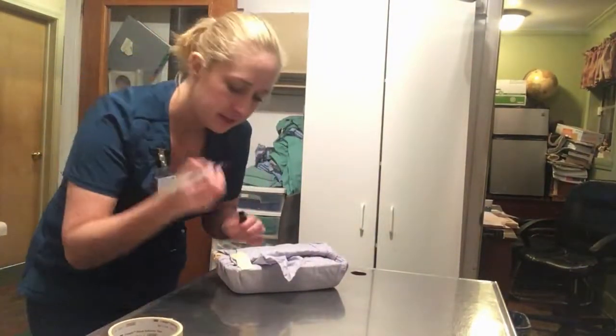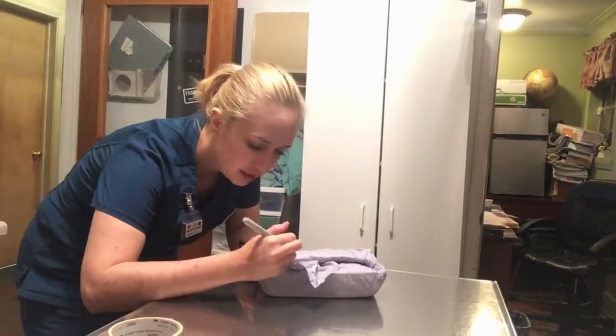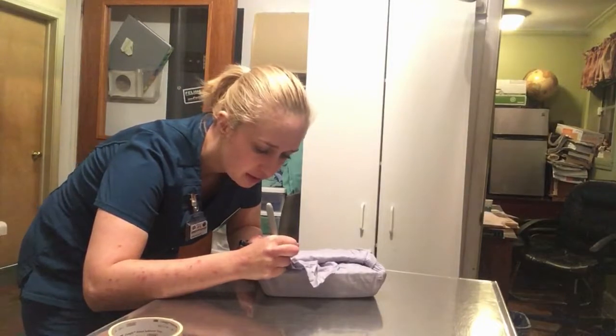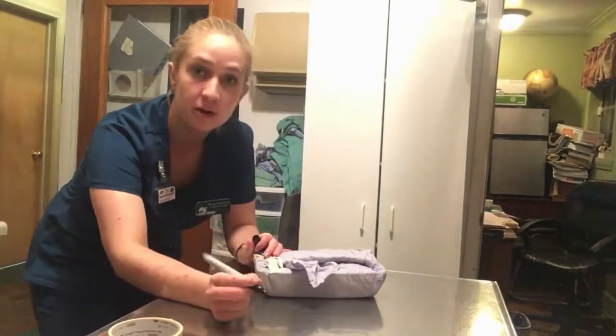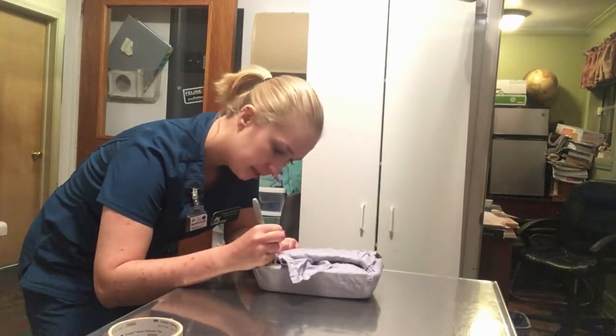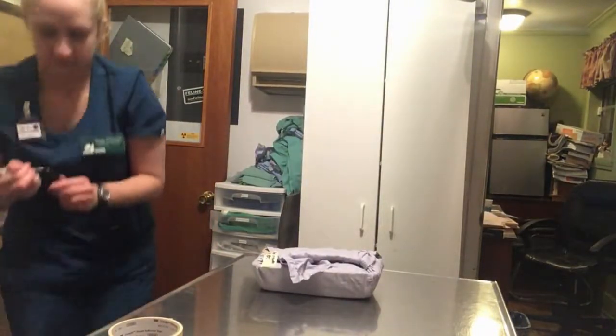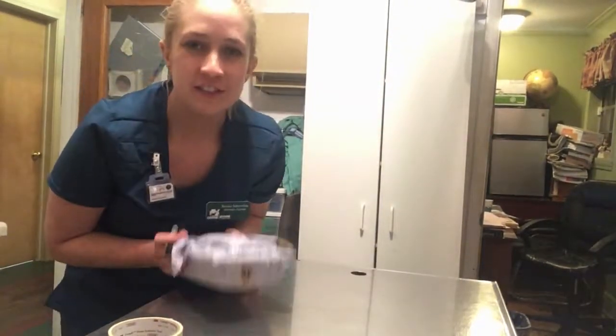And so then you're going to take a Sharpie and write down which pack you are sterilizing. This is going to be our brown neuter pack. And then I'm going to add today's date and my initials. Alright, now it's ready for the sterilizer.